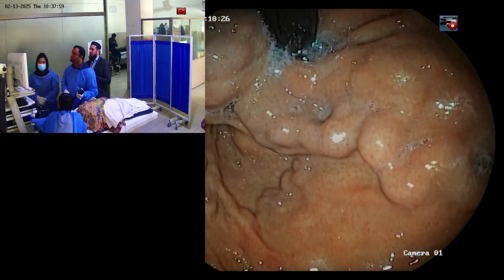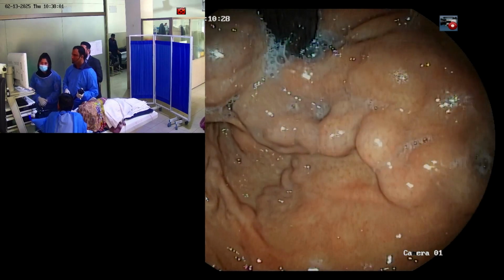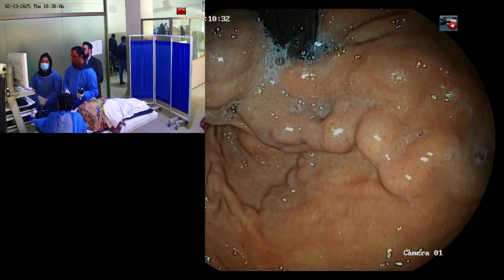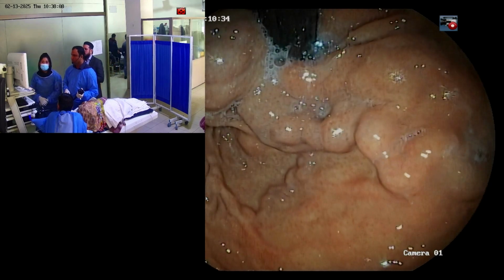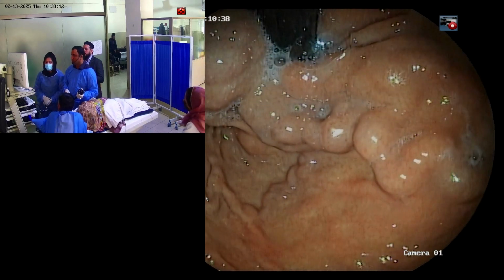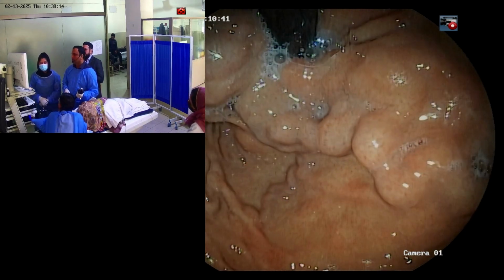And then you can come back and palpate. You don't have to do it all at one sitting. You can always come back and palpate, see which is a solid area. You don't deal with it. If it's a softer area, you inject 1 cc again with a coil. So that was the consensus there.